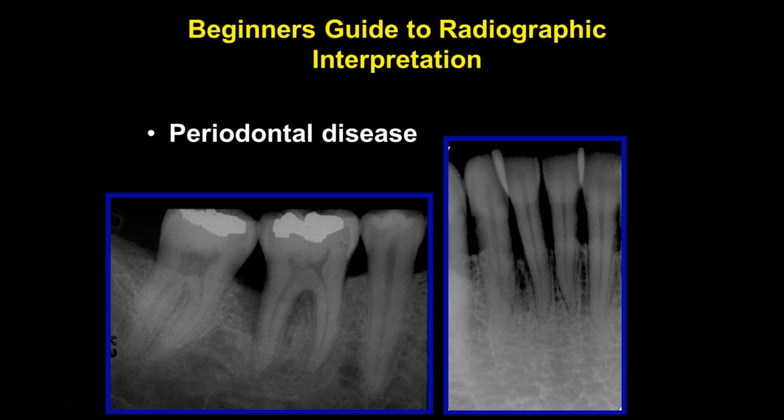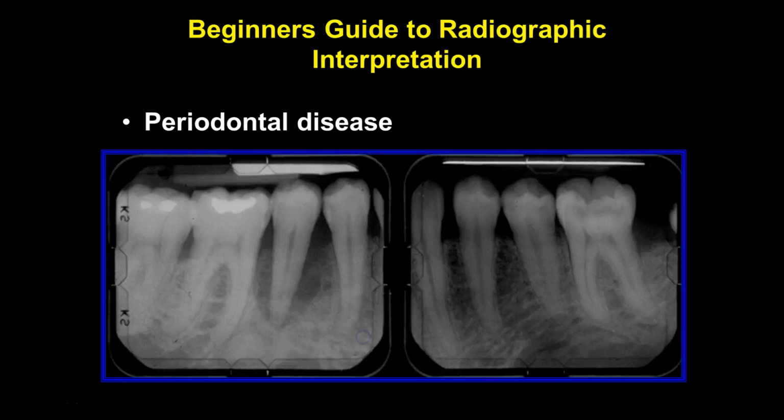If you don't know what that word means, it means pus. When you push on the side of the tooth, there's probably something ooey gooey going to come out of there because we have a significant defect right here. And if you trace it, it goes on around. Remember, you're looking at these images in the dark because it allows your eye to see the gray images more efficiently. So keep that in mind when you're always evaluating radiographs.